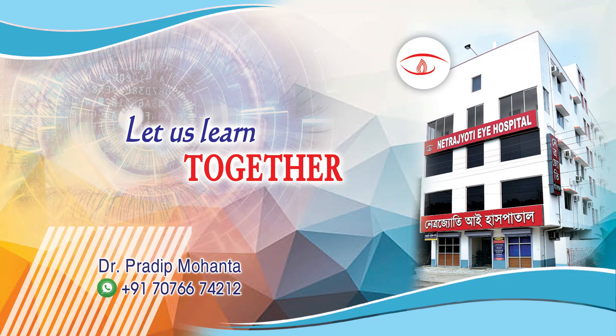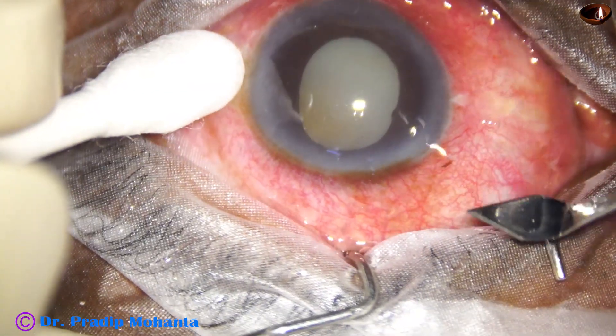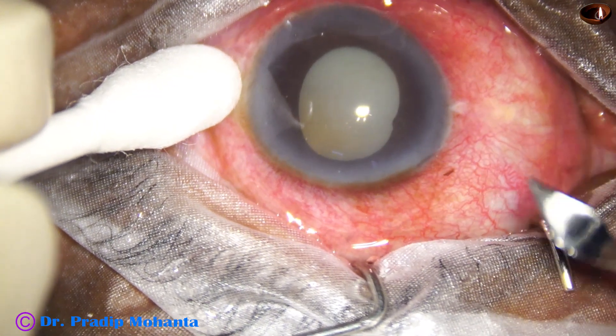Welcome dear friends. In this video we will see how to manage a hypermature morgagnian cataract and how to protect the posterior capsule at every step.